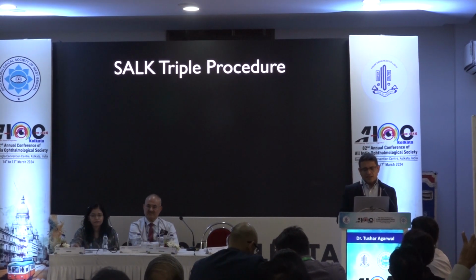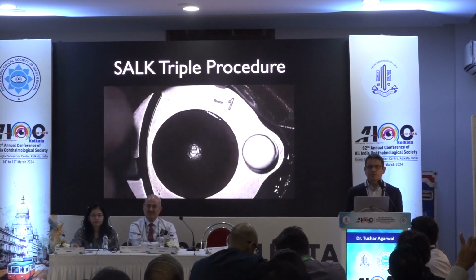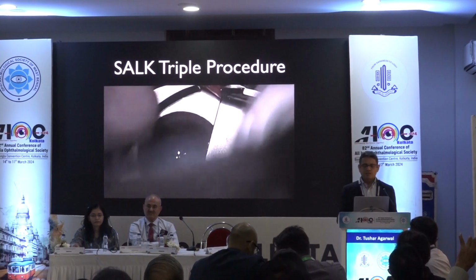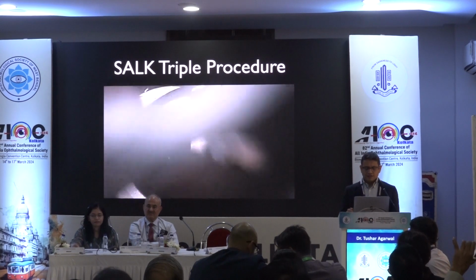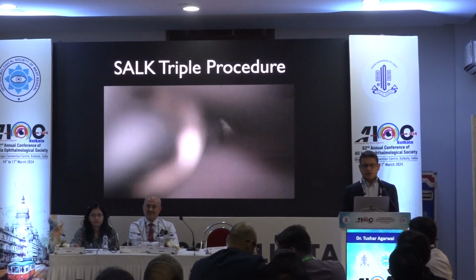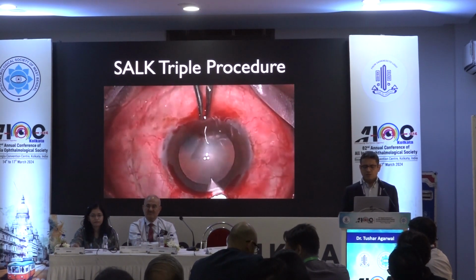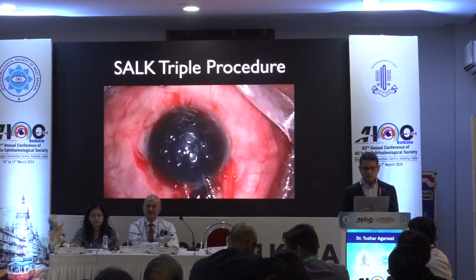Now this surgery can also be quite easily combined with the phaco if the patient has coexisting cataract. So what you do is that after you harvest the graft, you get a clear bed of the cornea. So at this point, you hold on to the graft, and you have just removed the host. The phaco resumes as in a normal case.